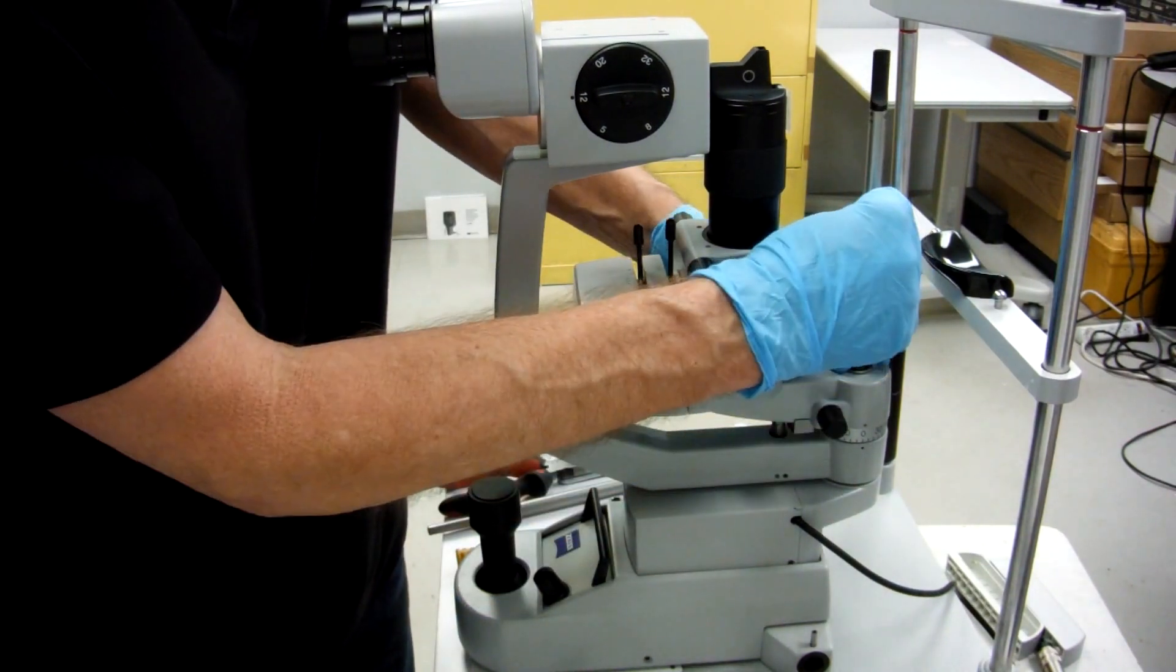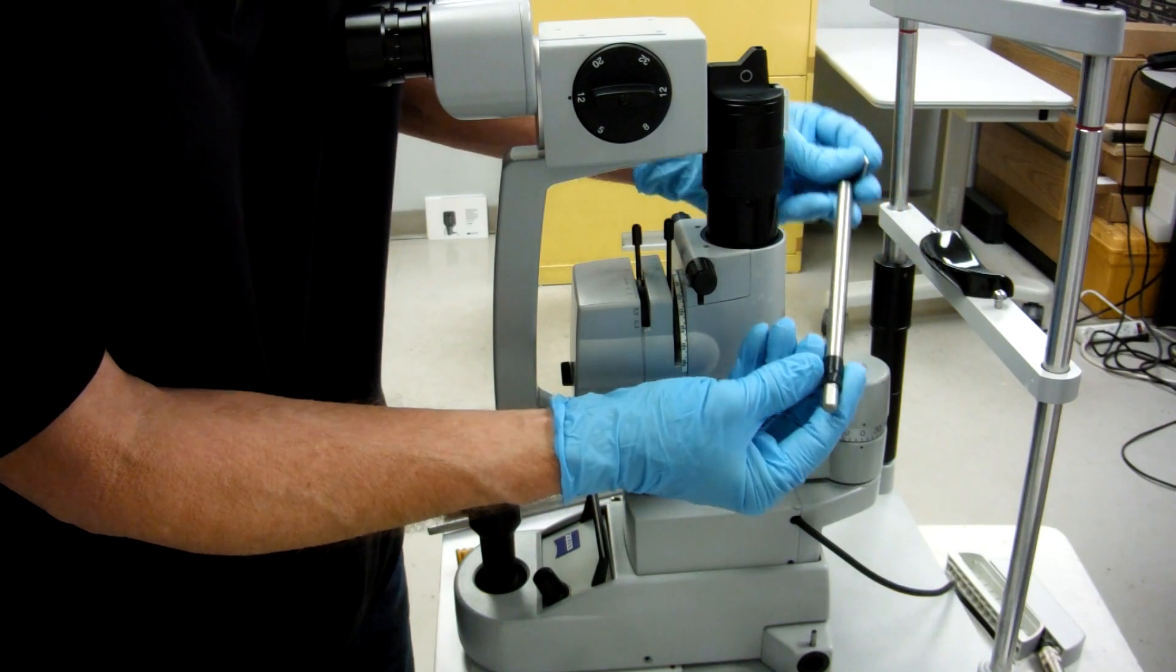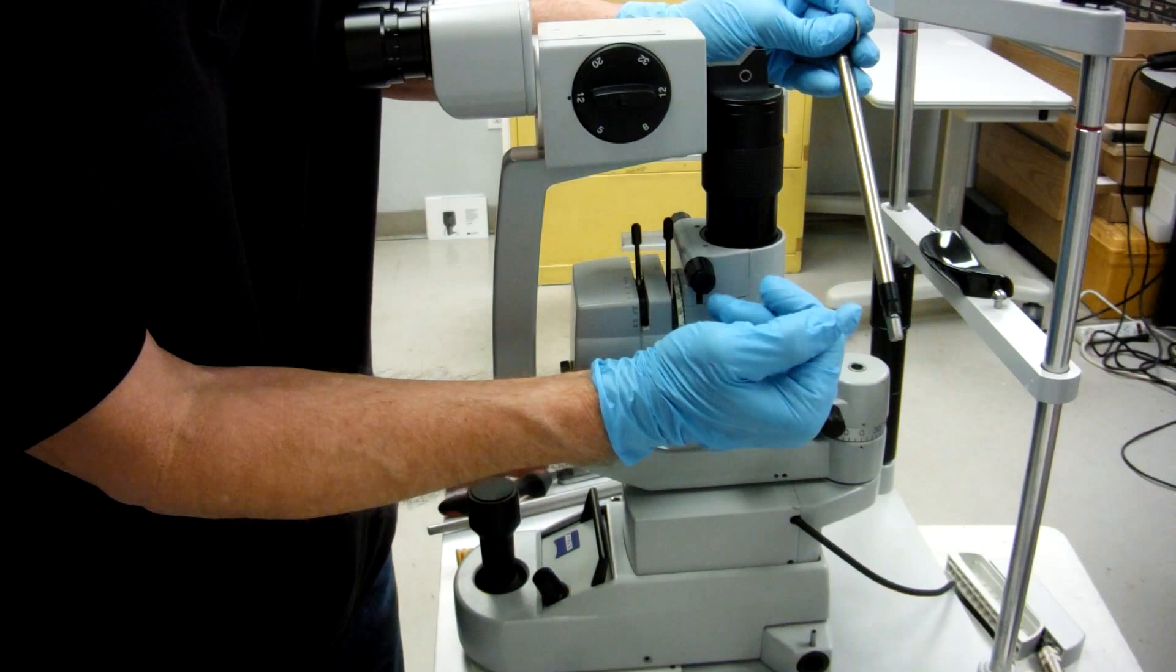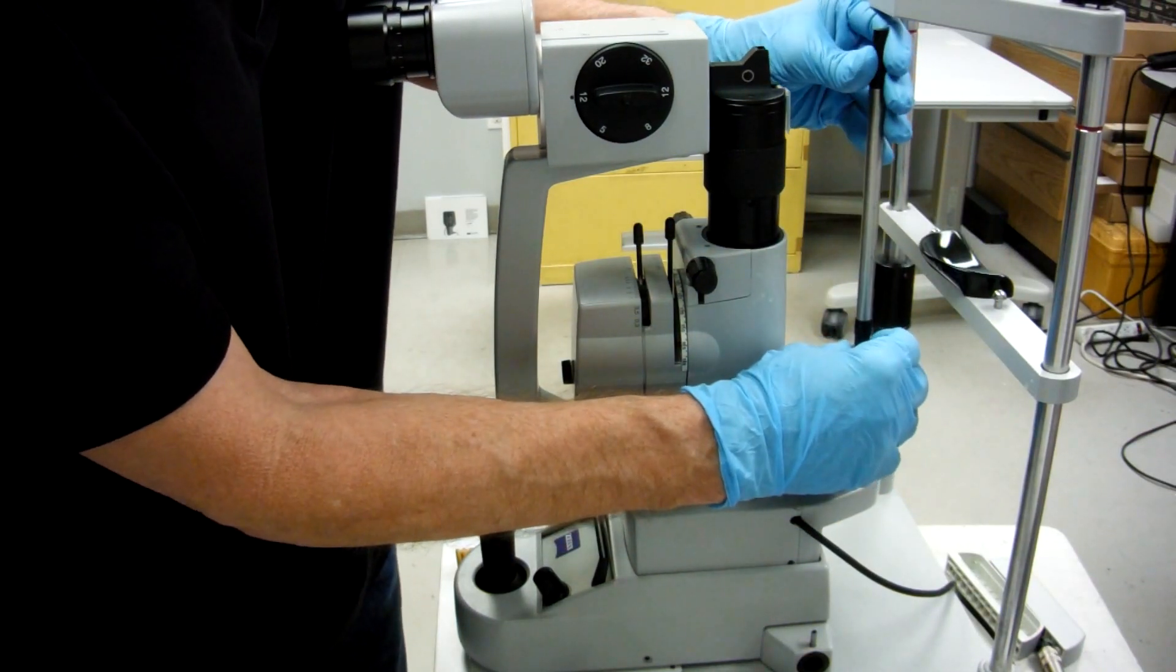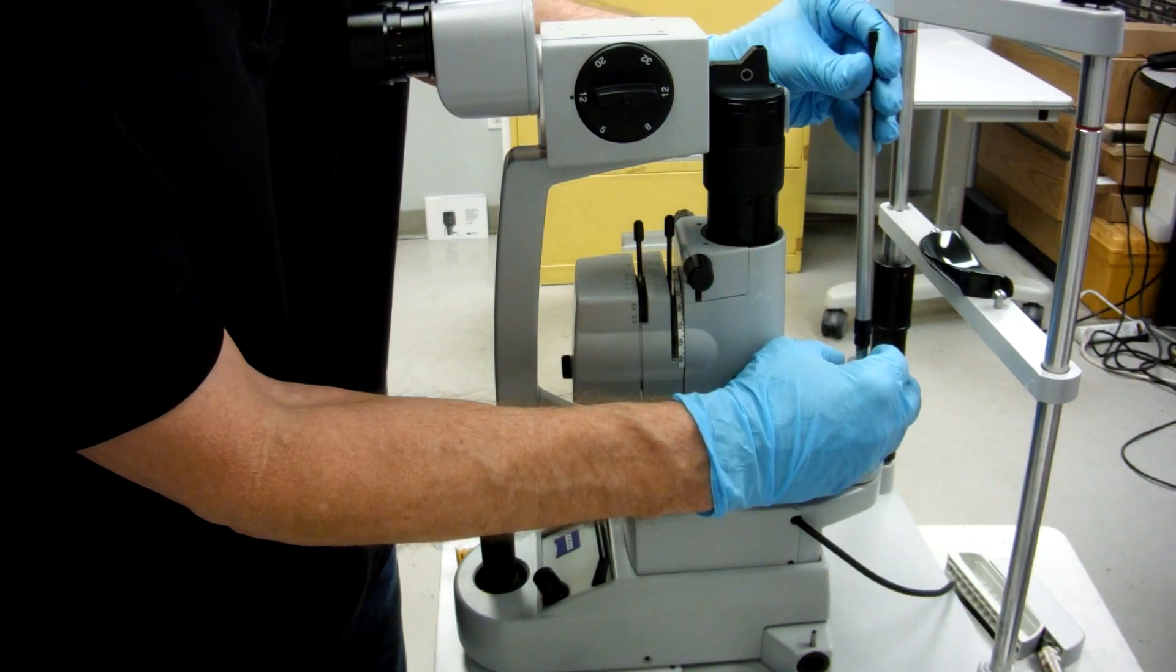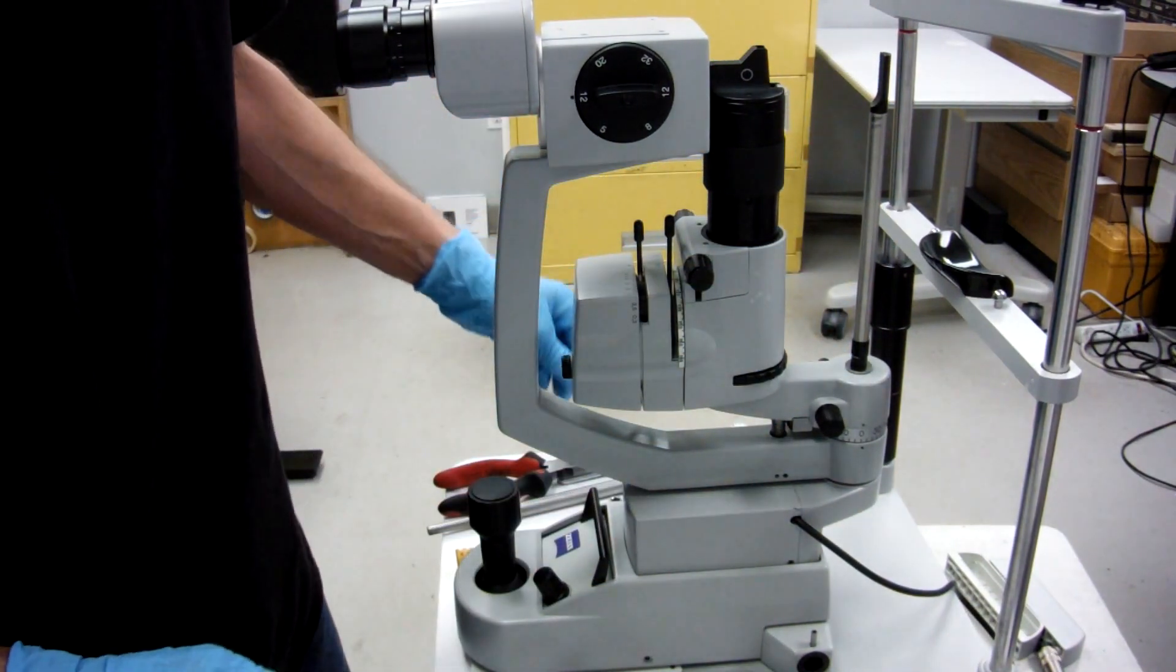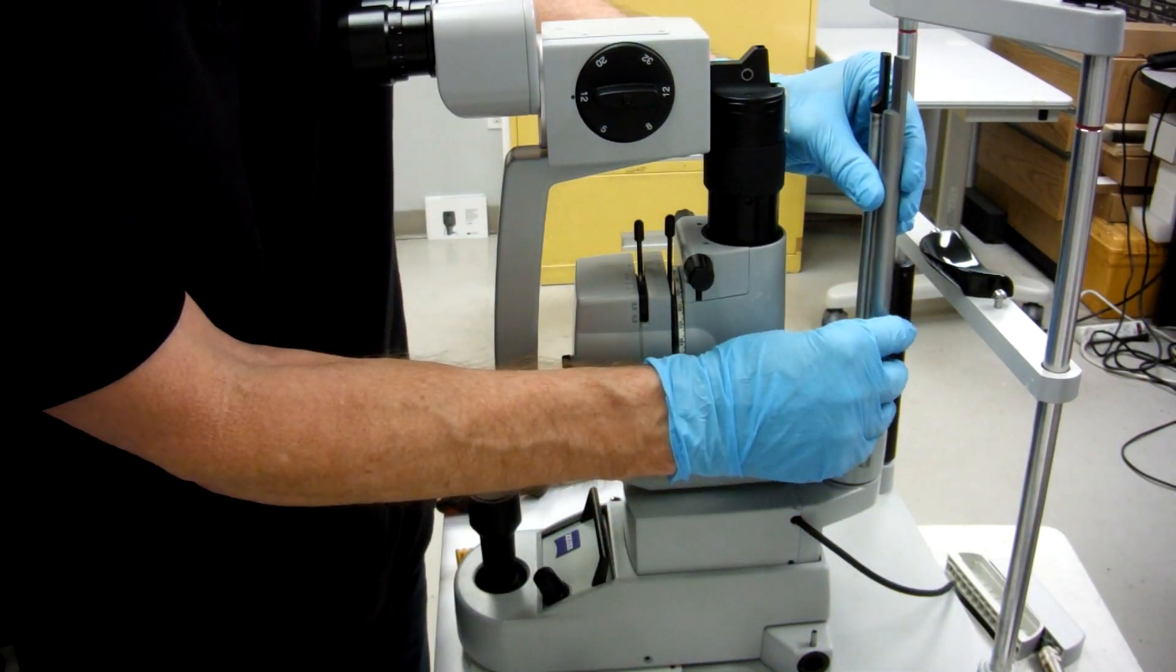You can make your own by getting your regular focus rod, putting some tape about three-eighths of an inch below where it normally rests, and it won't go down as far. Then it'll be as high as you need to be able to see your light.